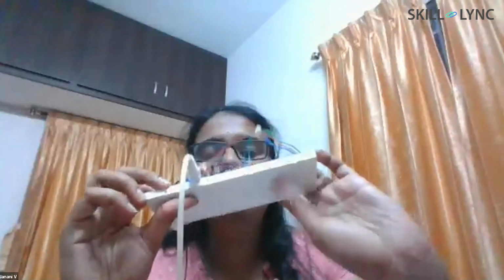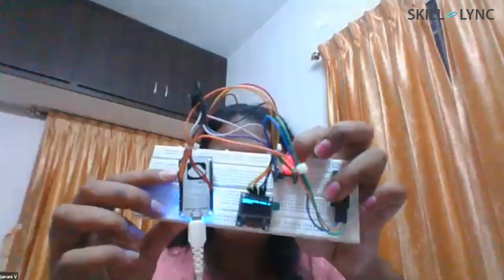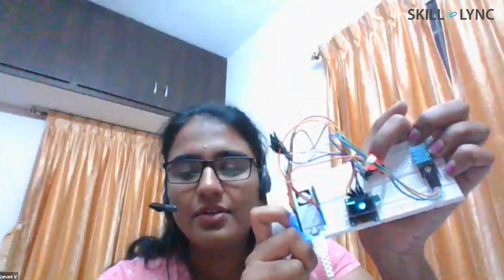And I thought of displaying the temperature and the MAX value. So once it is started, it will show you initializing pulse. Once the client application is on, it will show success and this symbol will get in. I had initialized my OLED also. When I keep my fingers here, it will take some time, guys, and it will display the parameters.